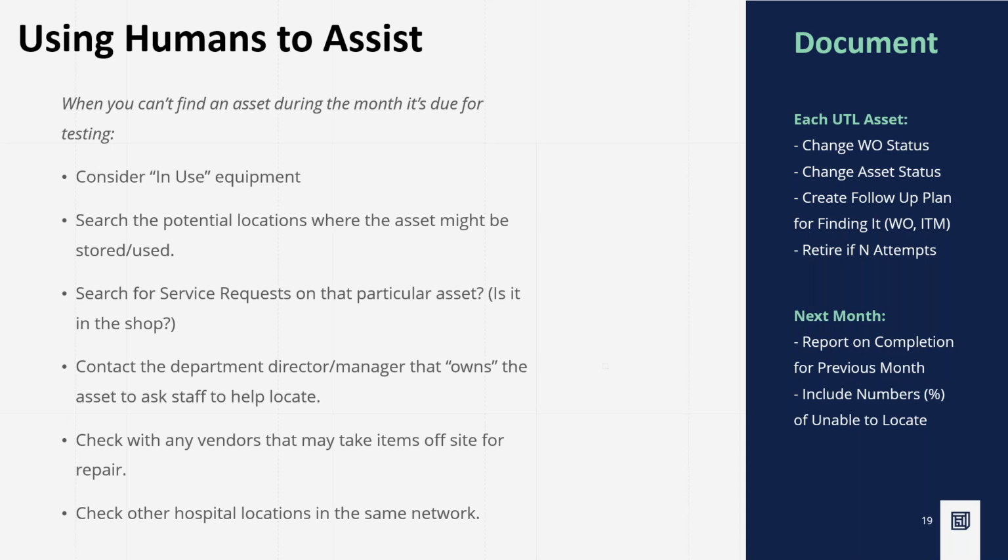Yeah, but I think just one thing to add about this particular slide, Joe, is we started off by talking about documenting a policy. So this is what this means for your organization. Now we're talking about how the humans go about trying to find it, and that's obviously an important piece of the puzzle. But as you just mentioned, 17,000 assets to 9 technicians?